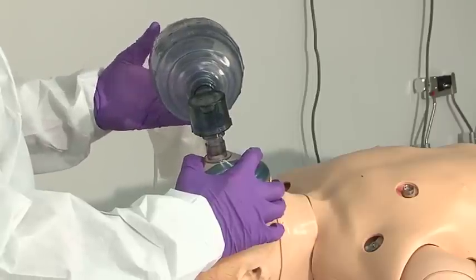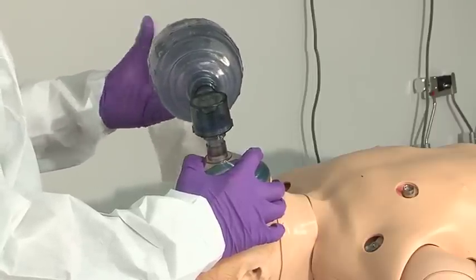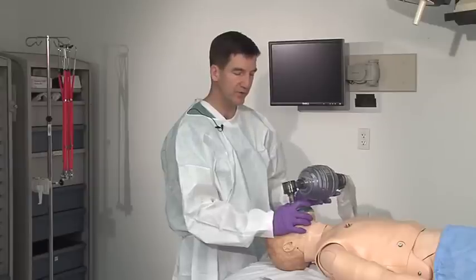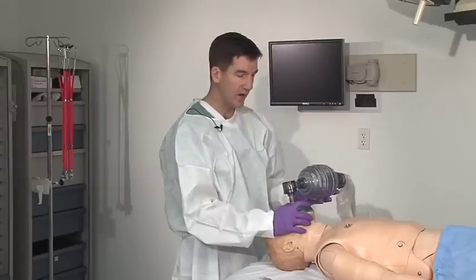I have my mask, I have my bag, and the oxygen supply is attached. I start with deep, slow, full respirations. With a good seal on the face, I watch for rise and fall of the chest.